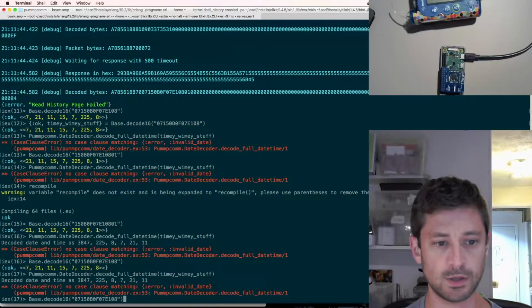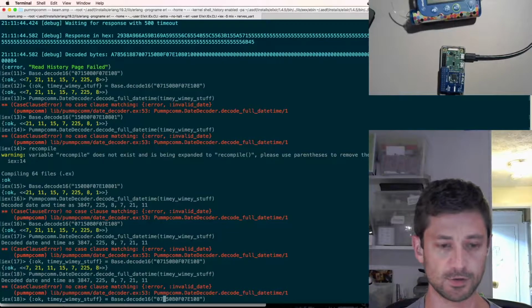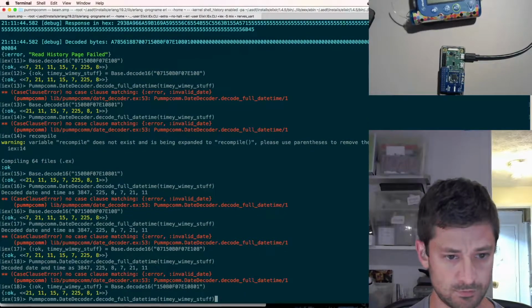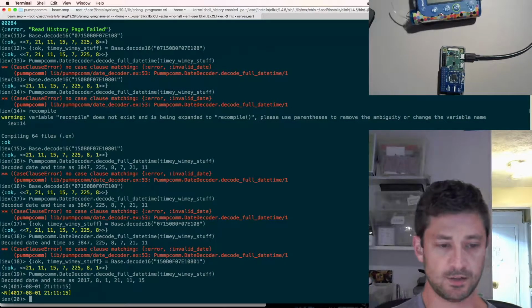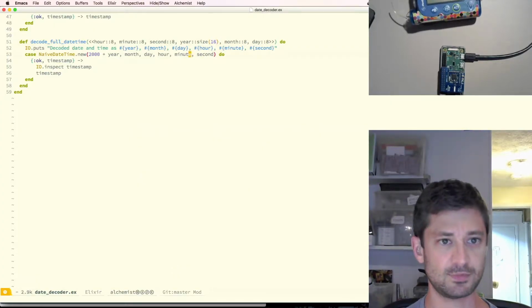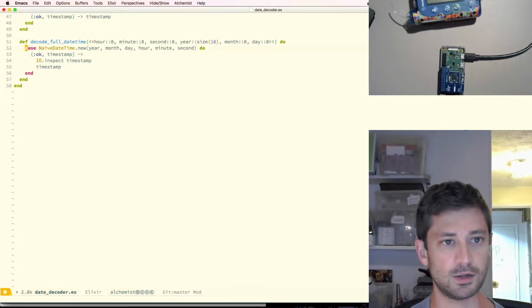Oh. Yeah. I see. Didn't actually assign that or do any matching on the new stuff. So let's try this again. Hey, look at that. August 1st, 21/11/15, and the year 4017. So that's off. I guess when you have 7 bytes to play with, you don't have to play games with how many offset years you have. All right, that's a good deal.